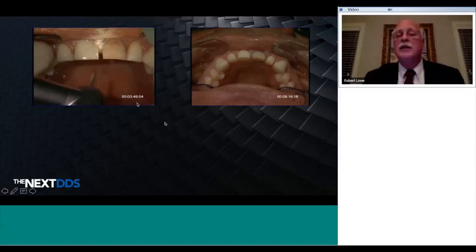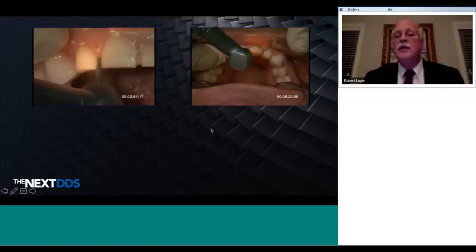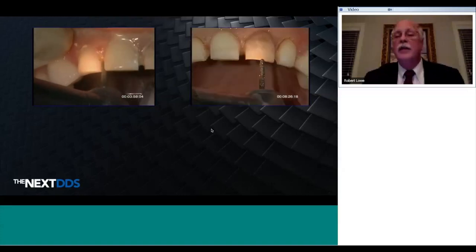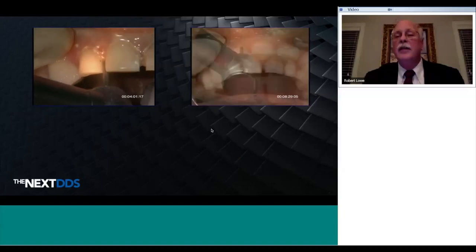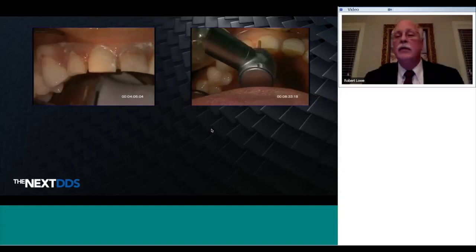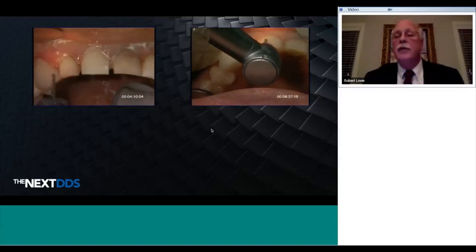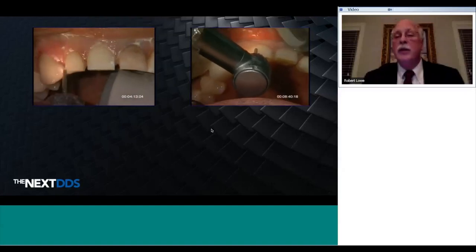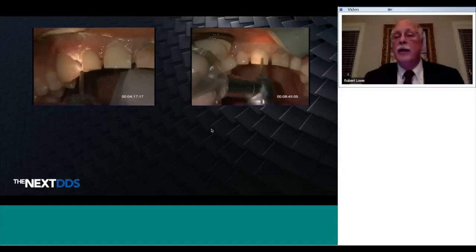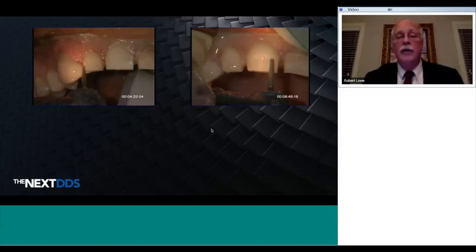Then over here, you can see in incisal view, we're going to make our depth cuts, first in the incisal half, and then in the cervical half, and then join the depth cuts. So I'm putting the burr in about approximately the radius. This burr is 1.2 millimeters in diameter. I want to make a preparation that's a millimeter or slightly less. I'm going to use a thinner burr and make my depth cut so that once I remove the tooth structure between the depth cuts, I'm not overprepared.